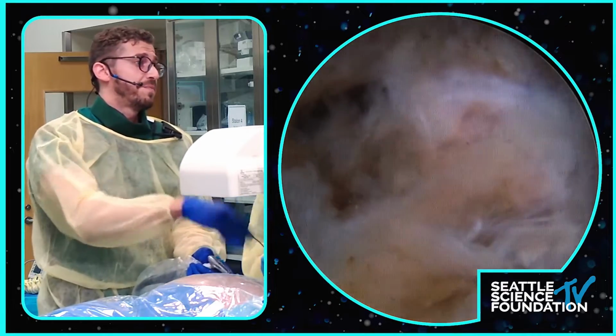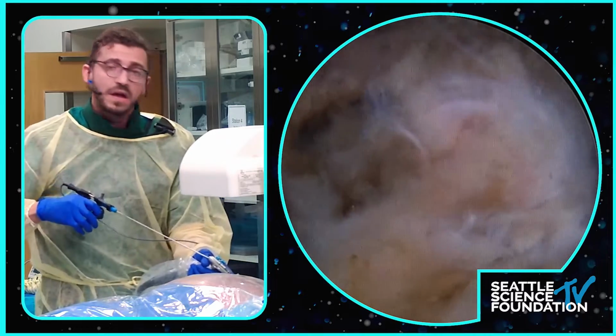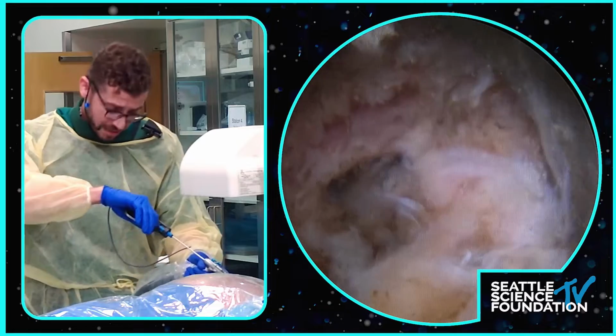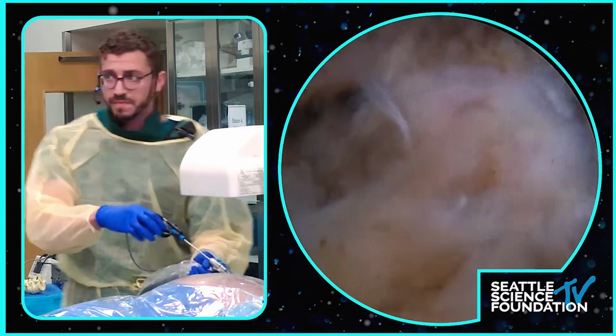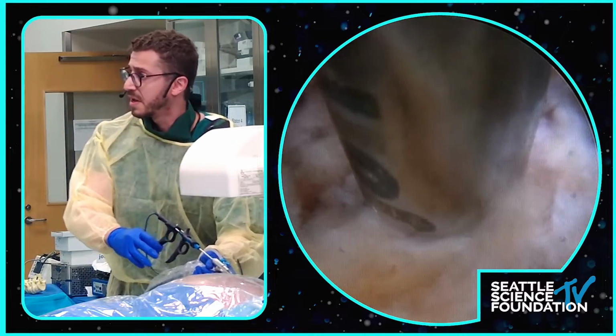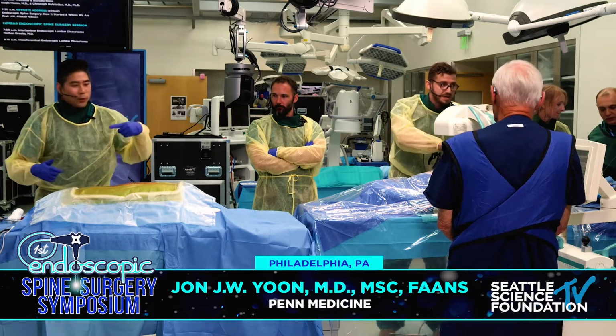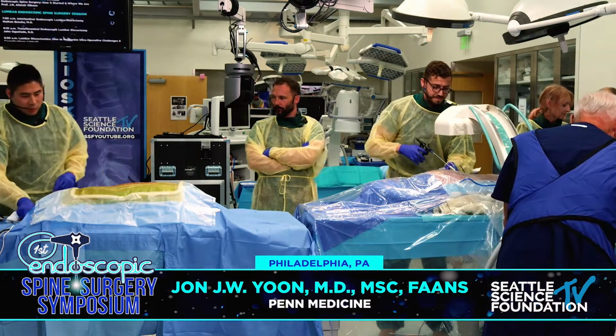So Osama, why don't we let Dr. Yoon show us the interlaminar while you prepare the traversing nerve root? Sorry, say that again? Why don't we let Dr. Yoon show us the interlaminar, while you prepare the traversing nerve root? Okay, perfect. Yeah, that sounds good. Do you want to come down?